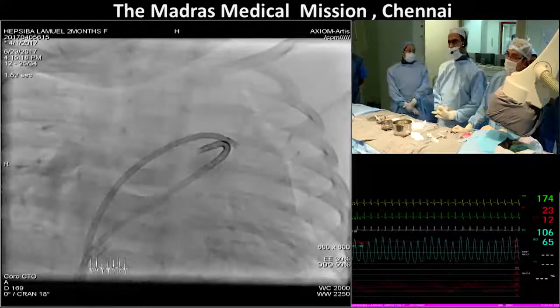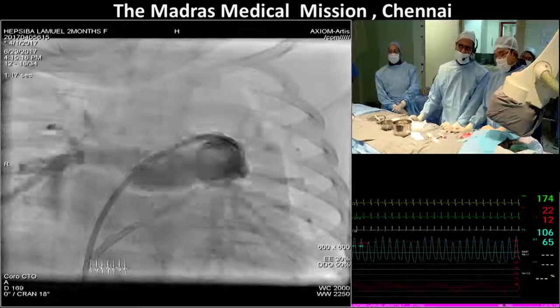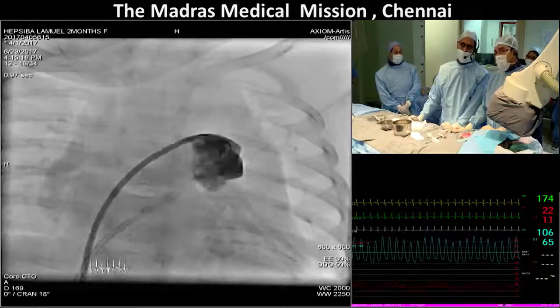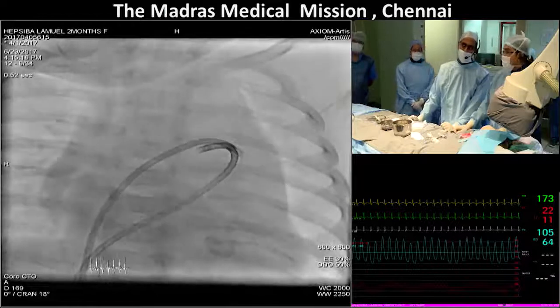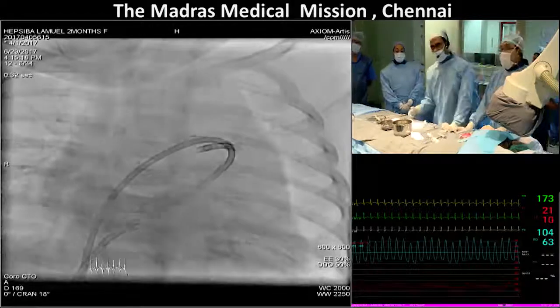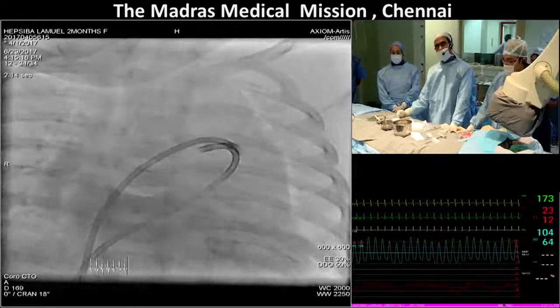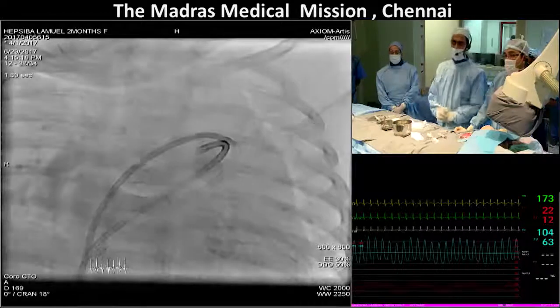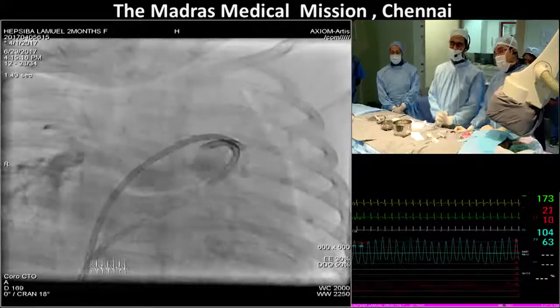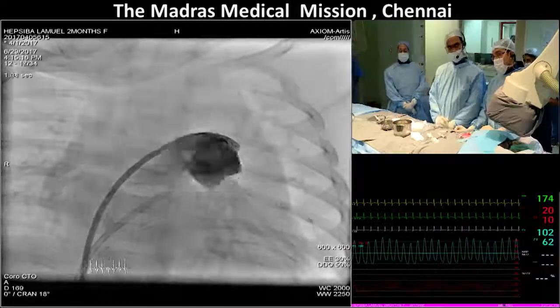Right now, what we have got is a catheter that goes from the right atrium through the left atrium and entering into the window, and another catheter is positioned in the main pulmonary artery for a check angiography. A communication between the right pulmonary artery and left atrium, which is slowly increasing in size in the last 3 months since birth, from 2.5 millimeter to 5.5 millimeter.